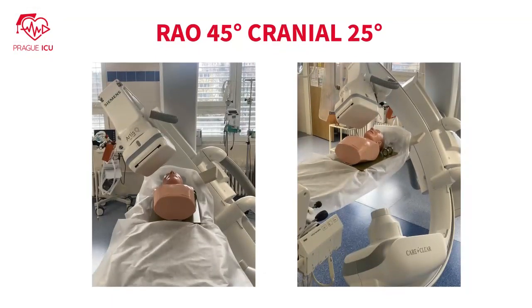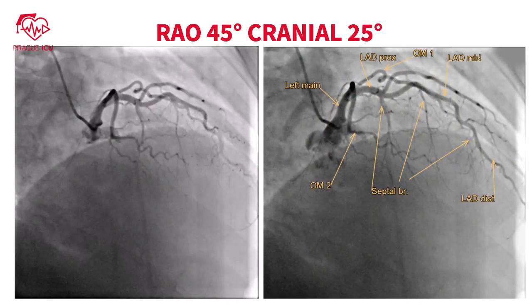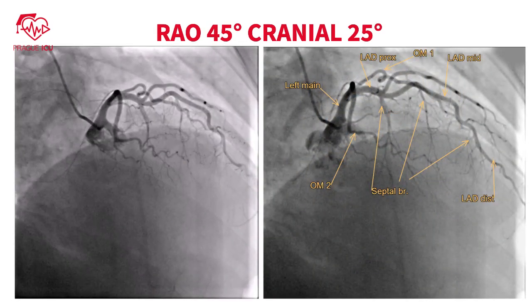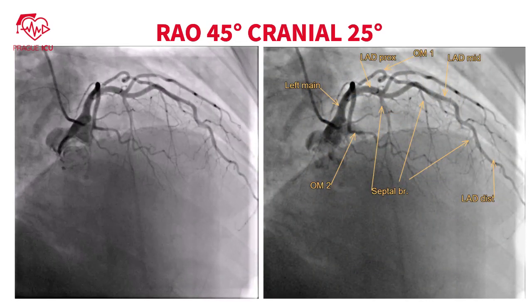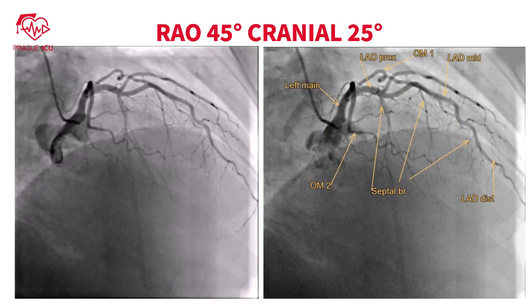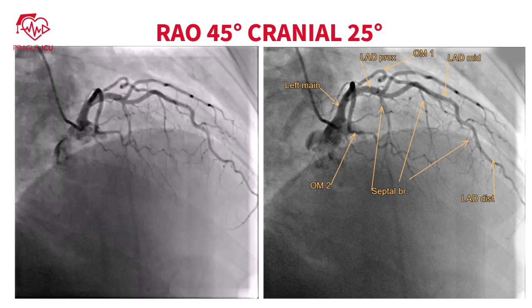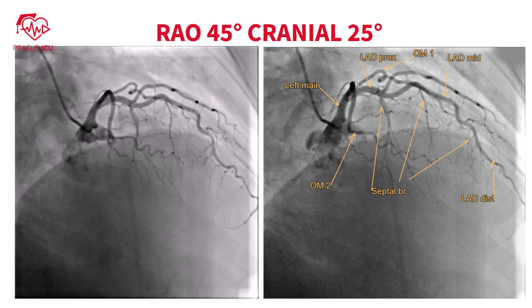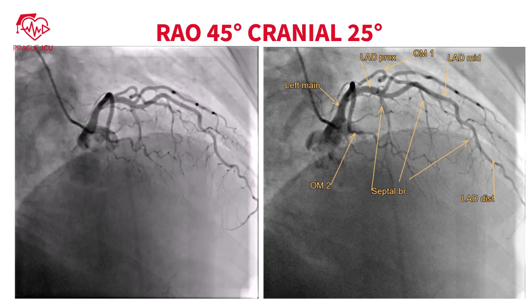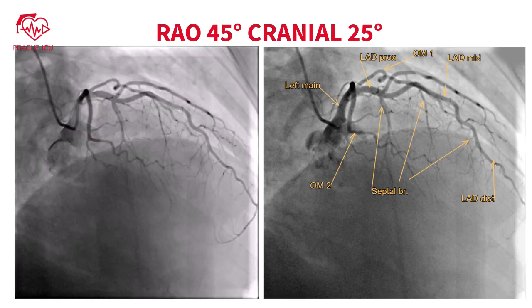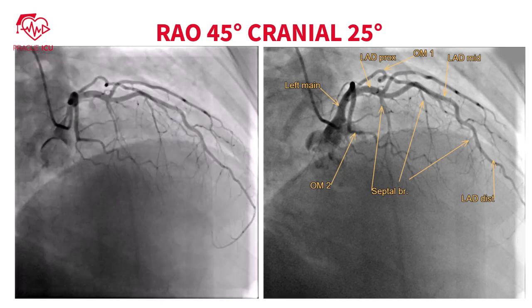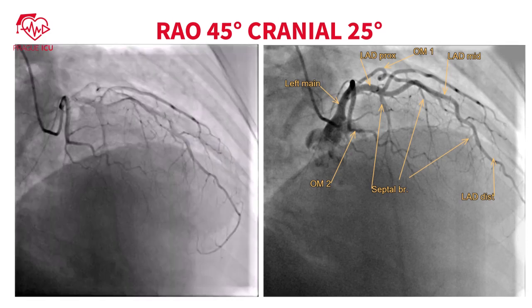Right anterior oblique 45 degrees cranial 25 degrees view is best for visualizing the LAD and septal branches. In this view, we plan which septal branch is suitable for the alcohol septal ablation.